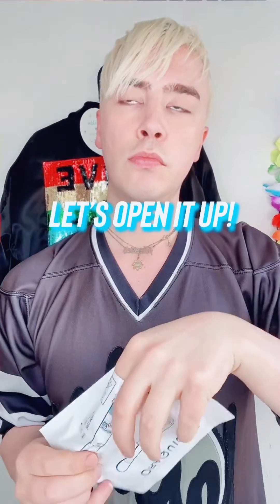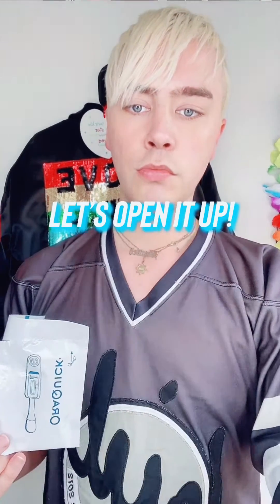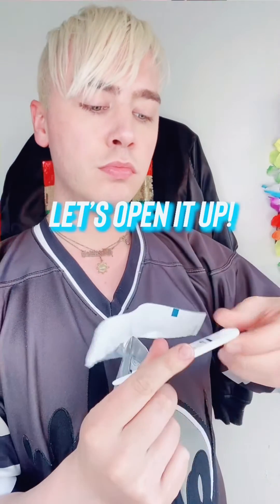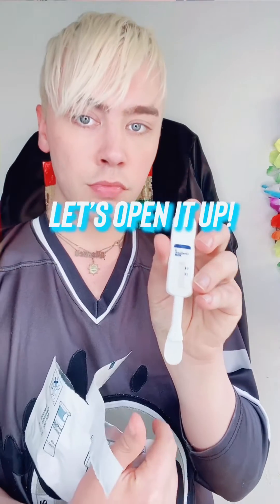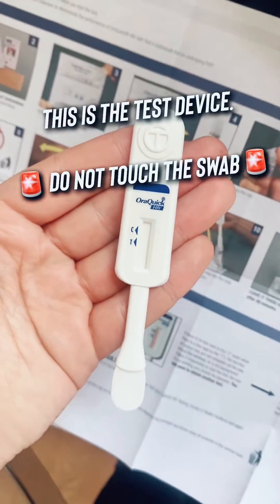Let's open it up. In one side we have the test tube which has a millimetre of liquid in it — be careful to keep the cap on. Open the other side: this is the testing swab, the part that will be going against your gums. Do not touch the swab, because you do not want to interfere with your results.